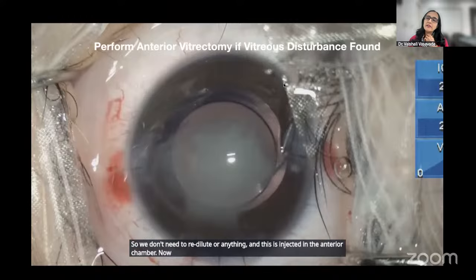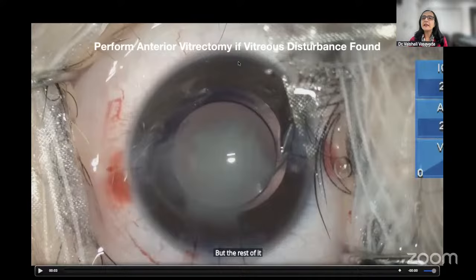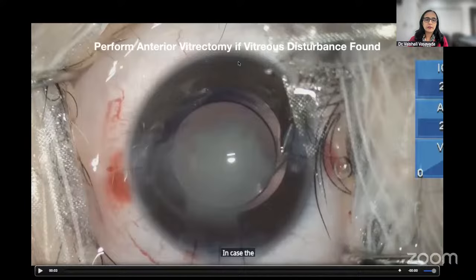Now, I like to leave it in the eye at the end of surgery for 2 reasons. Number one, if there was a vitreous strand, it will show me and then I can go with my vitrector and remove that. But the rest of it also acts as an anti-inflammatory agent. So I won't wash it off. I leave it at the end of surgery in case the compliance with drops is not very good for the parents.